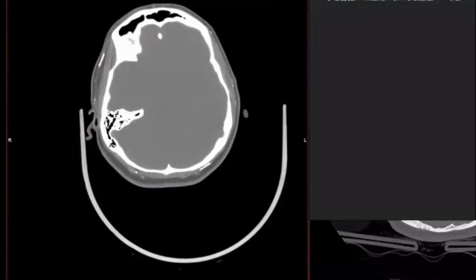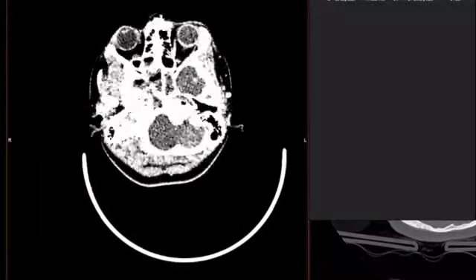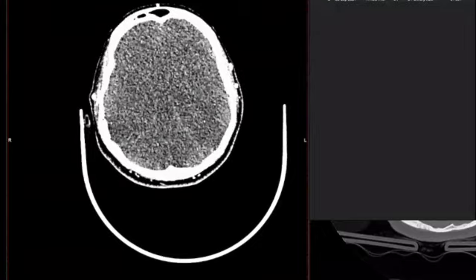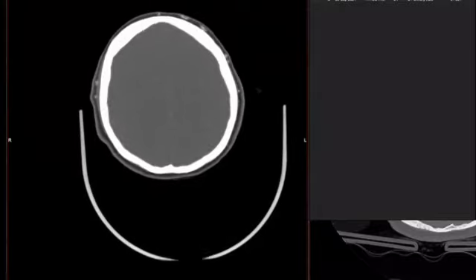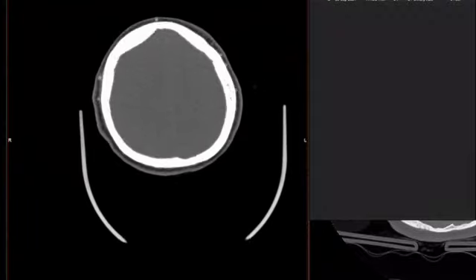You then move on to the 60-second study, which was a bit noisier in this case. And again, that was a technical issue. But what you can see now is these much larger vessels in the scalp. So this is the venous phase, and that tells you a story, doesn't it? That clearly things are fine extracranially.